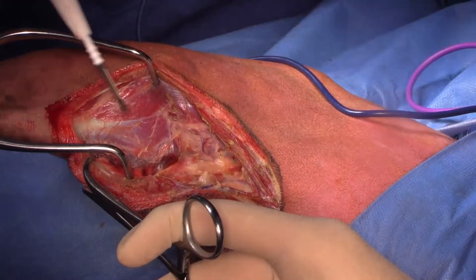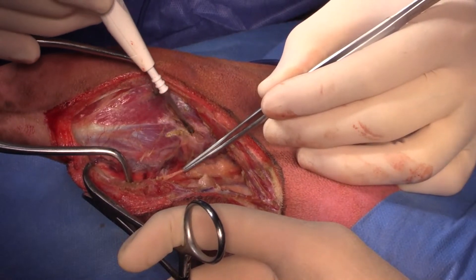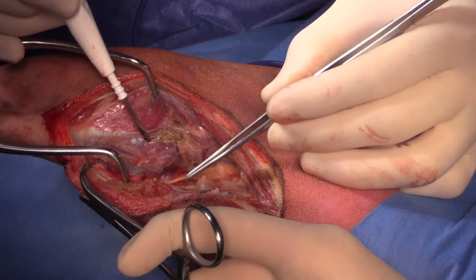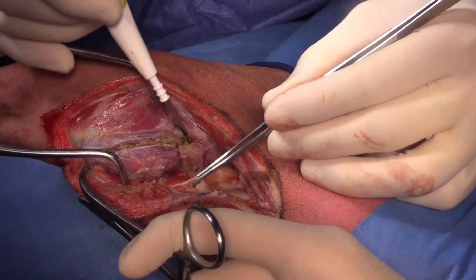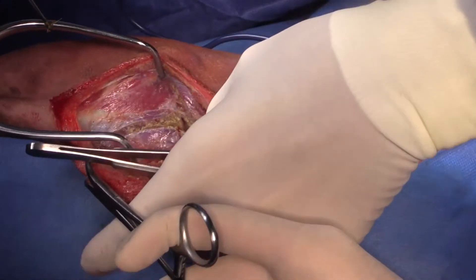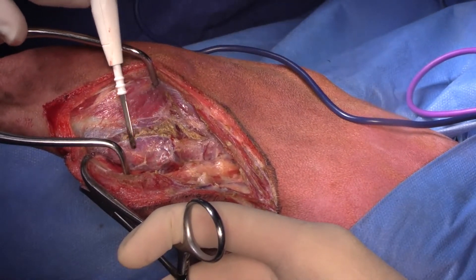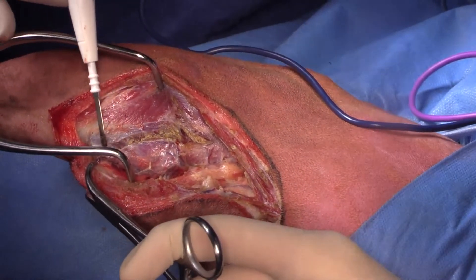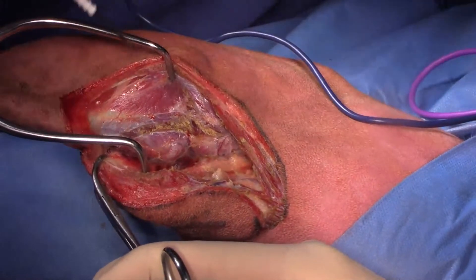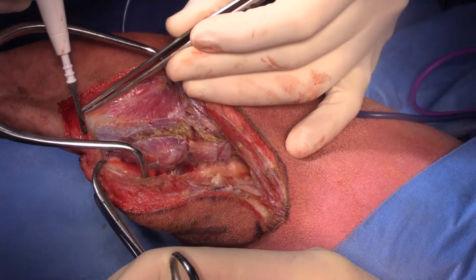This is gastroc muscle sitting right here. I'm trying to steer clear of that tumor — I can feel it within this tissue right here. And I can see some little hematoma-type things, which may actually be hemangiosarcomas right along that fascial plane there.